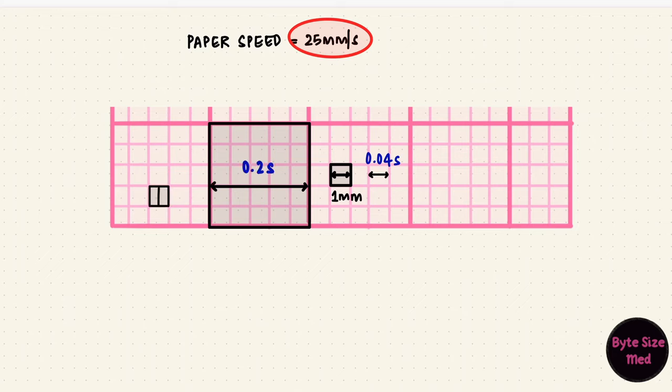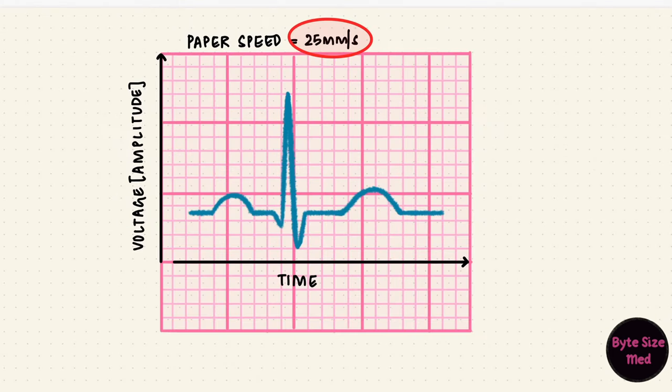Vertically, every millimeter is 0.1 millivolts. Which means every 10 small boxes or two large boxes is 1 millivolt. So if we assume a wave looks like this and it's now two and a half small boxes multiplied by 0.04 would give us a duration of 0.1 seconds. So that's the duration of this wave. So using these boxes, the durations of the waves, segments, intervals, and the amplitudes can be calculated.